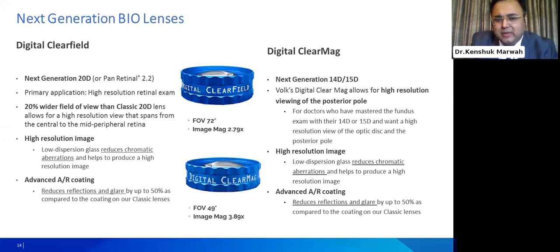So I would prefer that we start with a much better lens when we are training, so that we can see better. Because initially we get glares and focusing problems, we get disheartened, and we leave it in between, saying that I cannot do the indentation and I cannot see the retina. It is just about being patient and using the lenses.